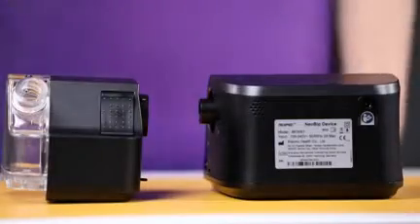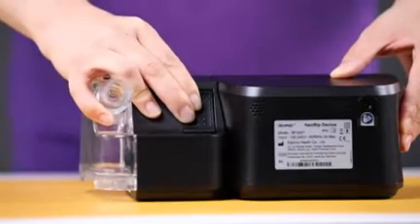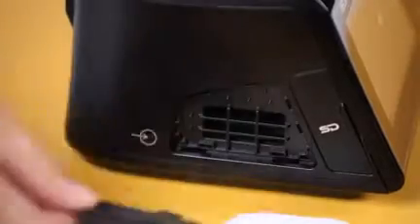Find the clip button at the back of the humidifier to connect it with the main device. The clip button is used for attaching and detaching the humidifier. Insert the air filter into the main device.